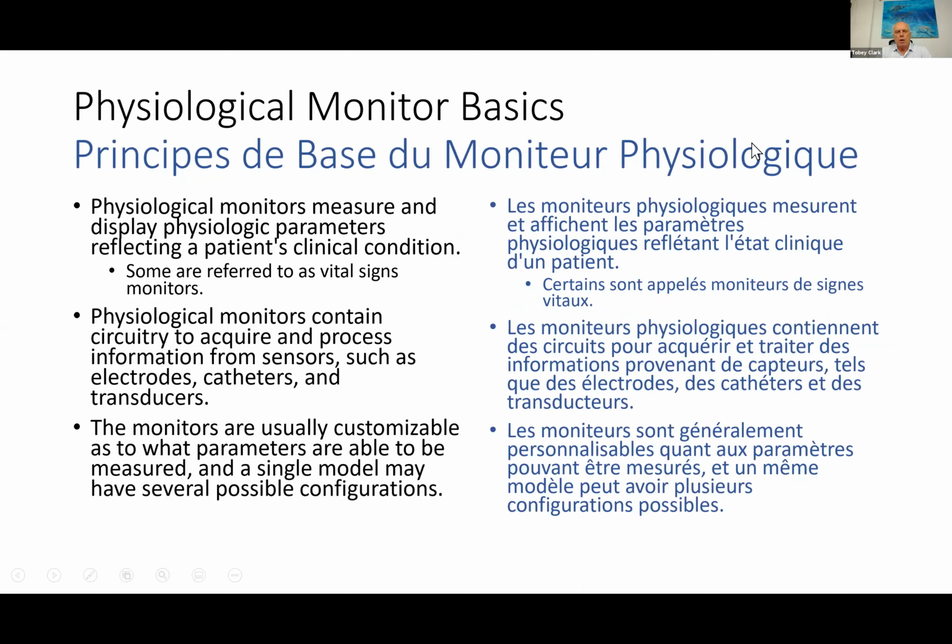So physiological monitors are a very basic tool in healthcare. They measure and display basic parameters that reflect the patient's condition. This monitoring may be continuous, or it may be intermittent, like a vital signs monitor.